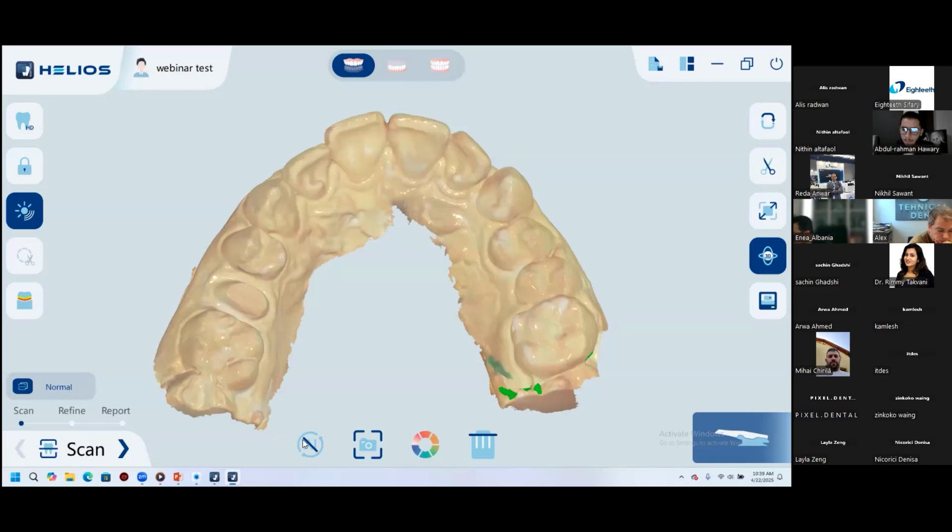Okay, we should take the bite from 2 sides, right and left, if you're taking a full arch scan. If you're taking a half arch, then take it from the start of the scan and from the end. If I don't have any occlusion on the other side, it's enough to take it anterior, from one side. I try to take it from another area also. If you have anterior stoppers, then take from the anterior stoppers.